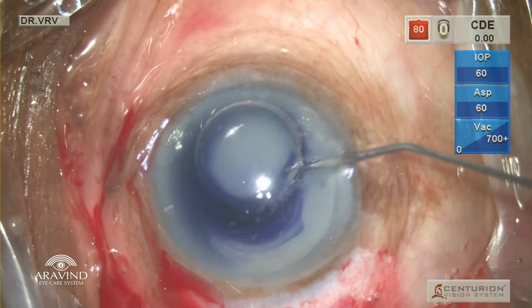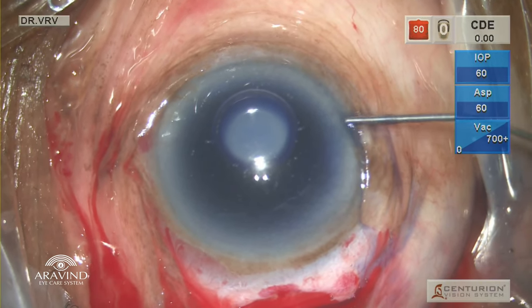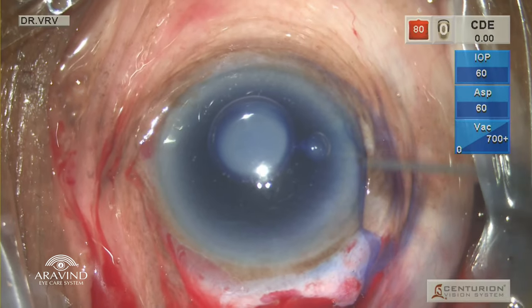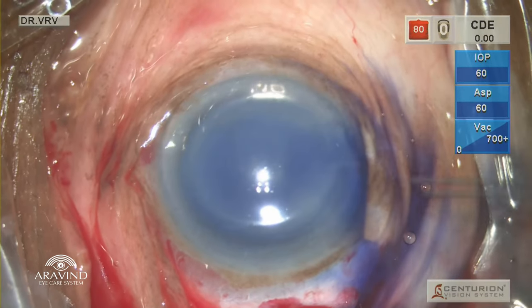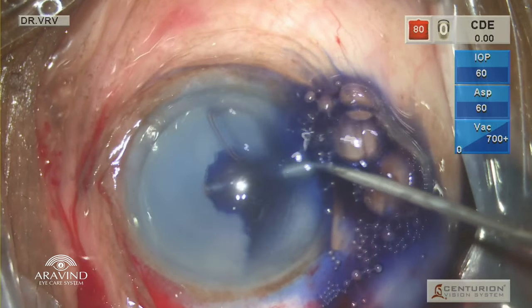A small air bubble is injected, following which trypan blue is injected into the eye. Again, a second air bubble is injected so as to paint the blue over the anterior lens capsule properly. HPMC is gently injected into the anterior chamber.